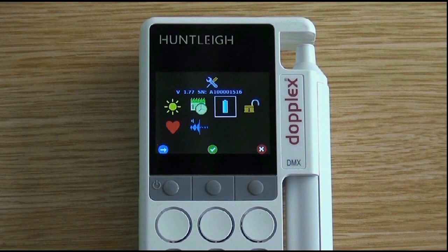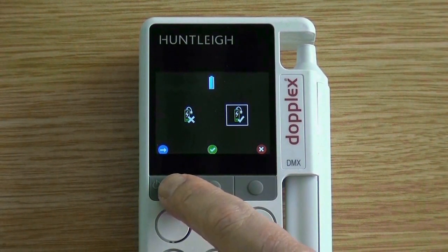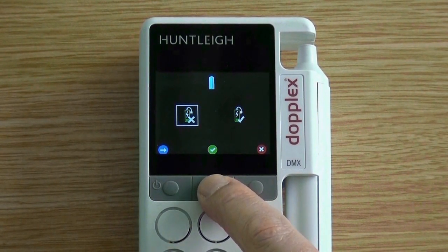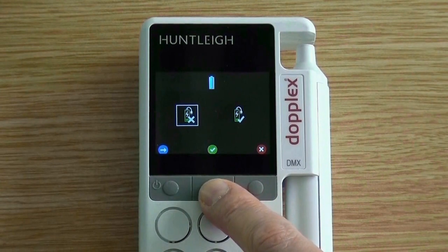Enter the setup screen by pressing the right button for three seconds. Press the left button until the battery symbol is highlighted, then press the middle button to select. If you have a non-rechargeable product, move the selection box to the left and press the tick to disable the charging capability. If you want to select the charging capability, highlight the battery symbol with a tick and press accept.